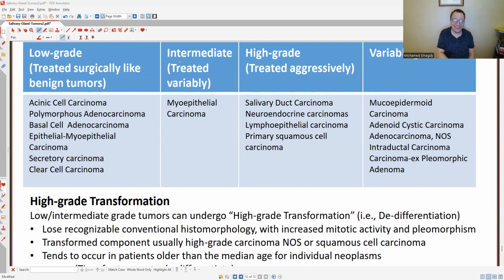That's how I will go over cytology. A lot of pictures. I might give you another picture of the same entity that I covered before, like a mucoepidermoid again, and then go back to it. So we will keep going back and forth until we get used to how each thing looks on cytology, so you get familiar with as many things as possible. Okay.